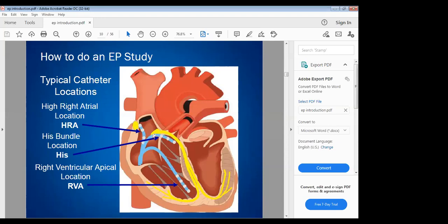So I'm sure we've all heard of, I'll come to your question, Dr. Adebowale. You've seen a defibrillator before. There are some defibrillators, not AED now, that have the ability to do external pacing. Those kinds of defibrillators, you use the pad. You put the pad on the patient, and rather than just defibrillating, you can do surface pacing. So even surface electrodes can pace, apart from intracardiac electrodes. You can actually pace the heart from the surface using the pads.